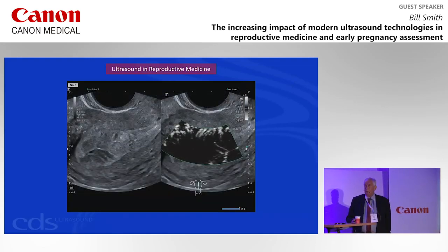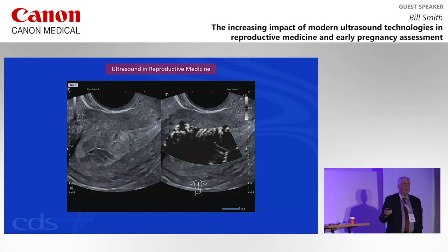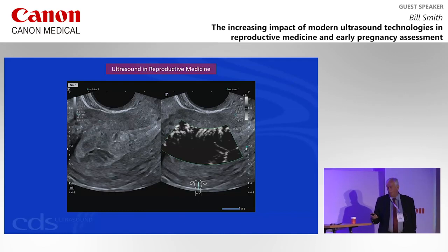So with the endometrium, it's very important to look at the grayscale. We must have this grayscale capability. We also use color Doppler, this is SMI actually, and it's monochrome, in terms of looking at the endometrium. This endometrium is too thick. We know this is a proliferative endometrium.